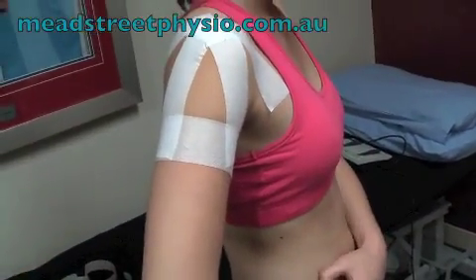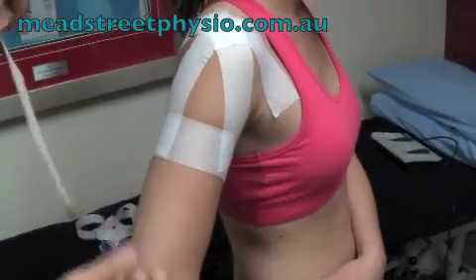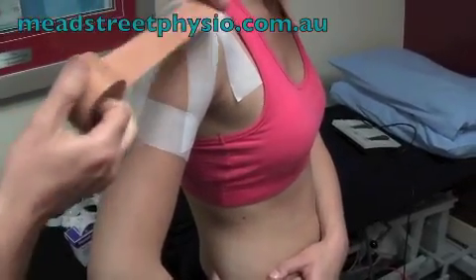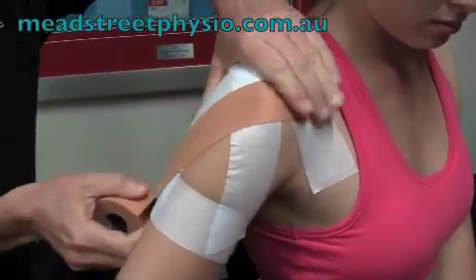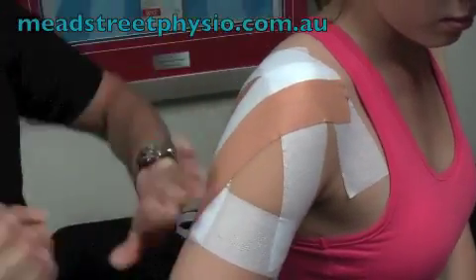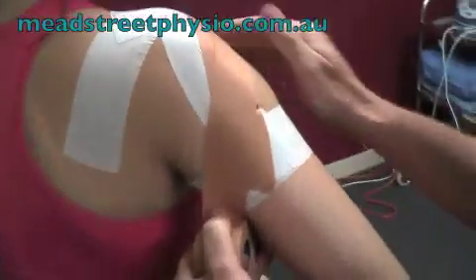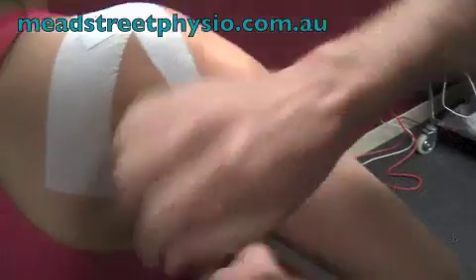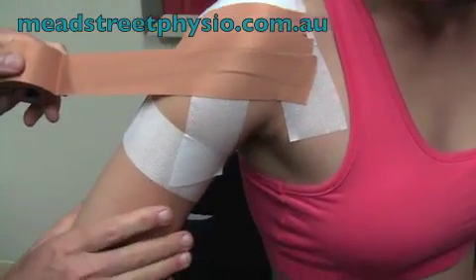Okay, so now we can move on to the sports tape. What we're going to do here is pop that shoulder into that position, and we're just going to wrap that down. We fan that tape around to the back of Jess's shoulder, again to stop that shoulder joint from moving forward. We want to make sure that tape doesn't extend too far into the armpit, otherwise that will create some problems when she goes to move her arm.